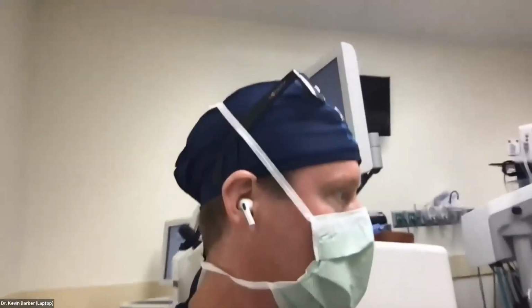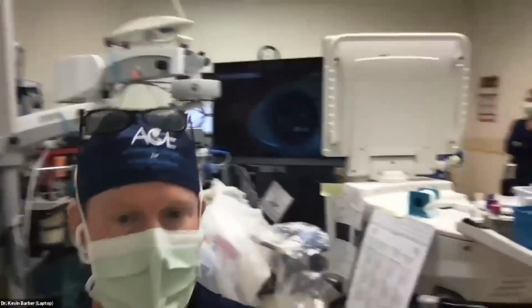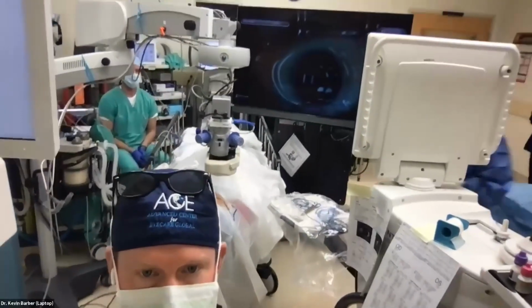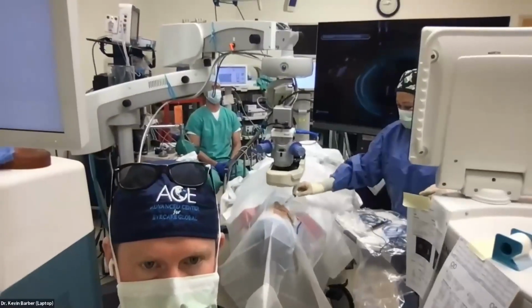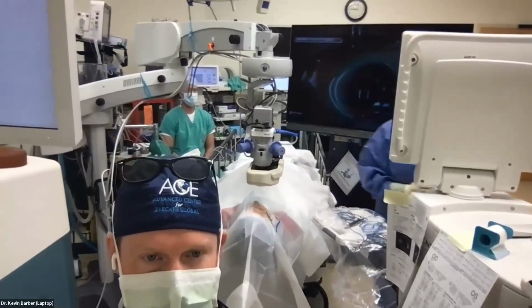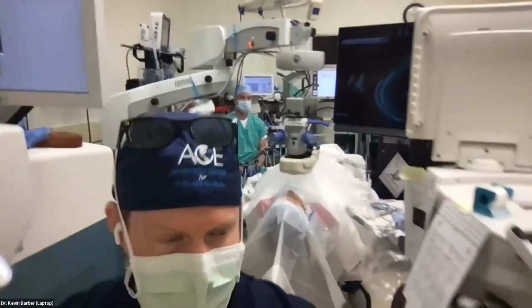Before scrubbing, I just wanted to give you a little context. I'm going to be using an Ingenuity, a 3D heads-up display, so you can see the large 3D television here. Our patient is ready to go. I sit at the 12 o'clock position. To my right will be Juvie, our excellent scrub tech and mind reader. And over here we have John, our anesthesia provider, who will keep everybody healthy and happy. And so with that, over to you, Hunter. I'm going to go scrub and get started on this case.